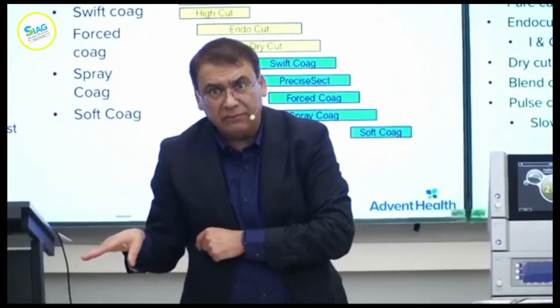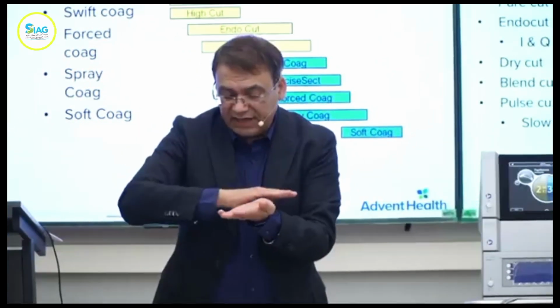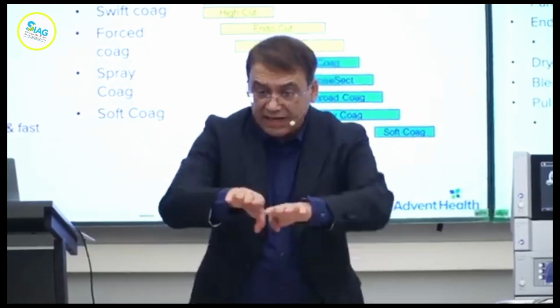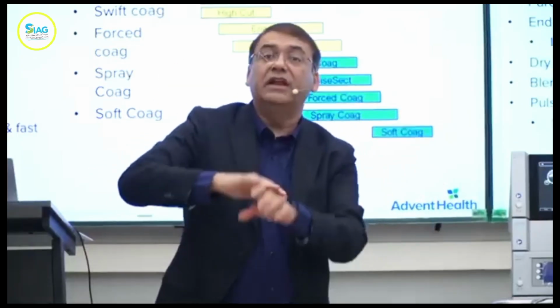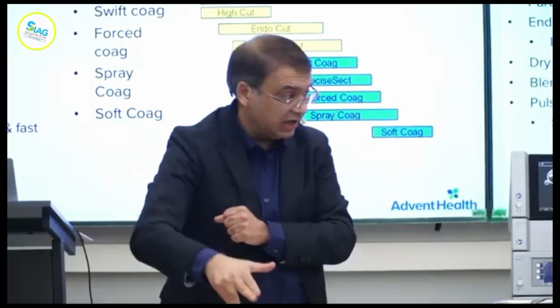But the grounding pad is not burning. All the current is coming out of the same place because it has a lot of surface area touching that pad. So the current is dispersed. It's not as strong. But if it's at one tip, it's going to be really, really strong and do a lot more damage. That's how it cuts.